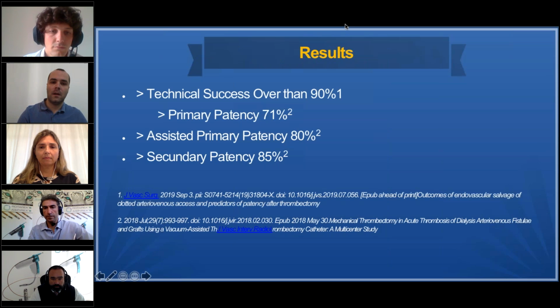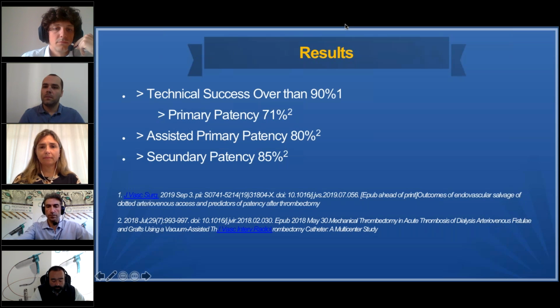I made a review of the literature, and there is a meta-analysis from the American Cardiology with 31,000 patients using the transradial approach, and complications are really rare. Occlusion doesn't pass 5%.